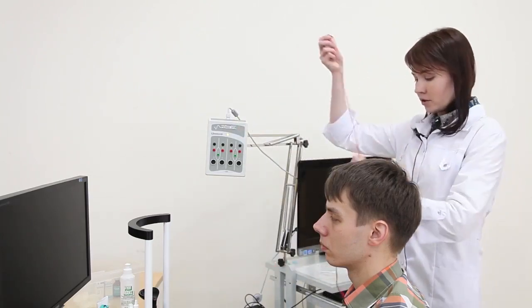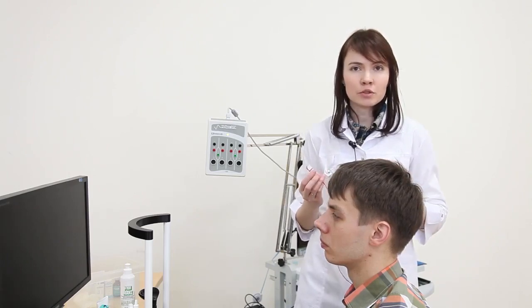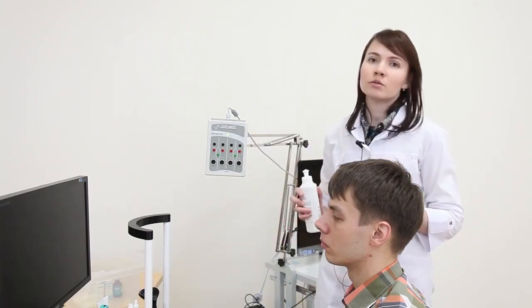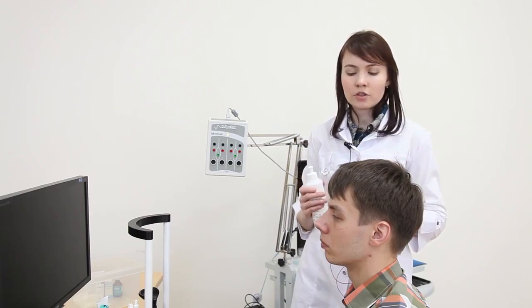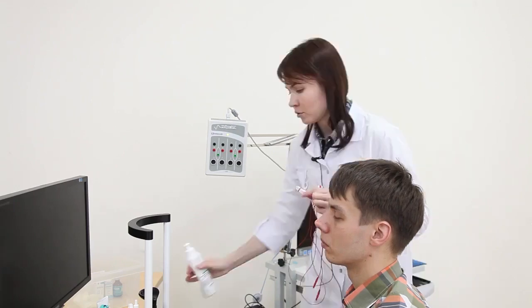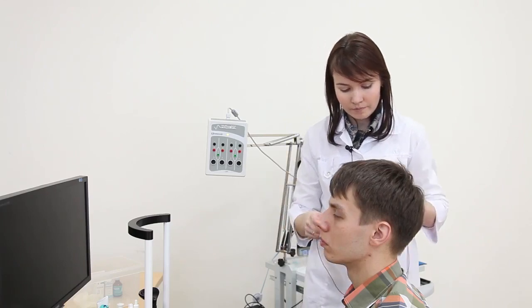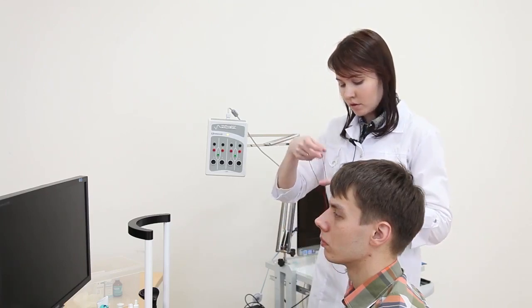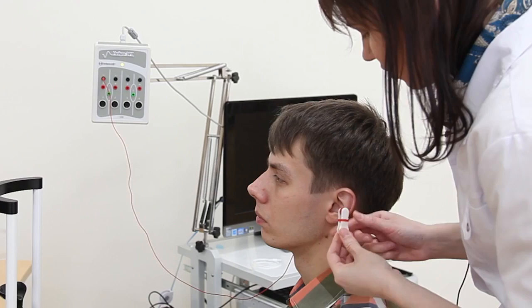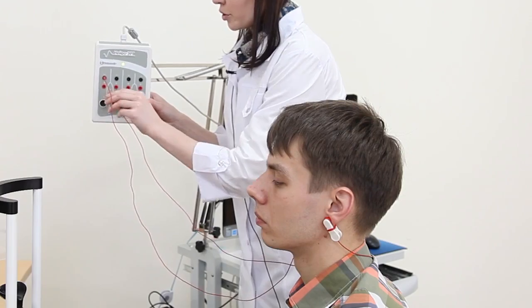The special ear clip cup electrodes are used as reference and ground electrodes. As I already told you, the reference electrode is placed at ipsilateral ear lobe. Thus, if we test the state of the right eye retina, we use the right ear lobe. Before the electrode fixation, it is moistened with a current conducting gel and then fixed to an ear lobe. The electrode connector is plugged in the minus input on the electronic unit. The ground electrode is fixed to a contralateral lobe and plugged in the ground input colored green.